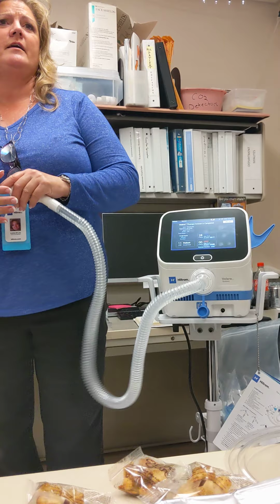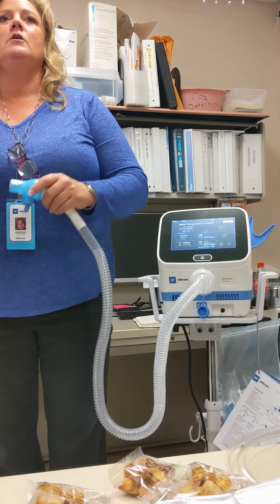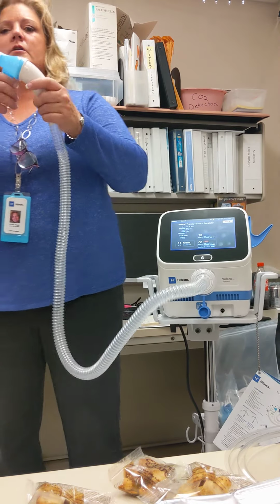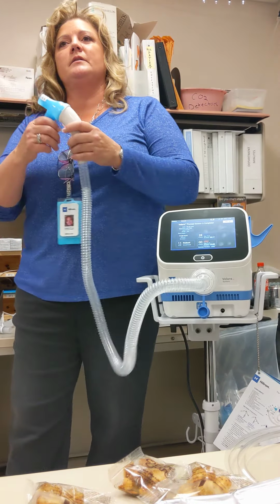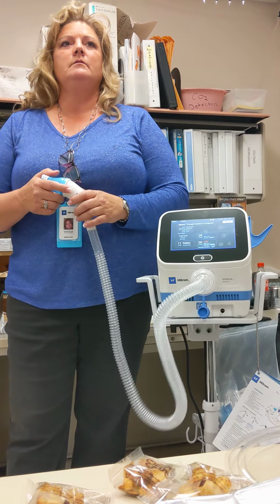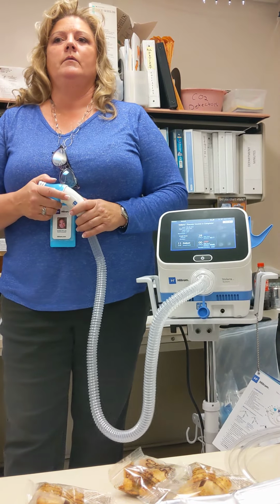Now, do you guys use Aerogen? We do. Okay. I would use Aerogen. You could do this one and put your nebulizer in there, but it's just weight. You don't want that. So just use your Aerogen. That's great, what you're doing there.